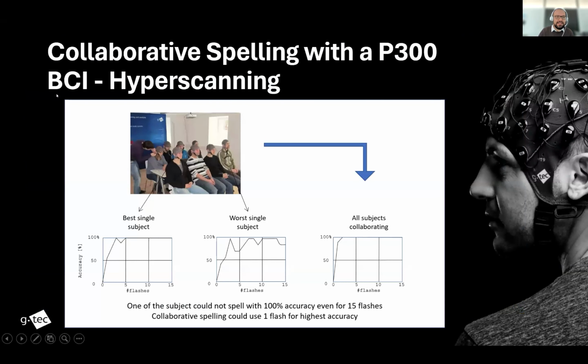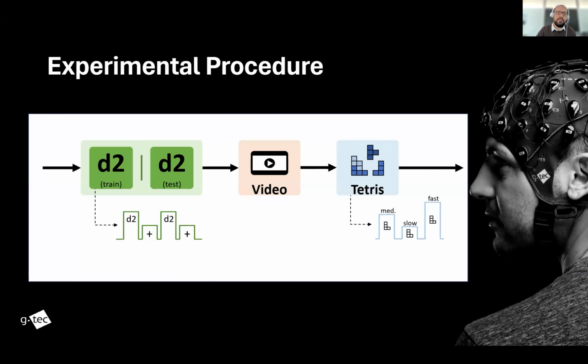and we were trying to catch the engagement of all of them and rate it with a bar that would move up depending on how engaged they were during this process. The experimental procedure at that time was doing the D2, which is an engaging task, very similar to what we will do today, where people have to select all the Ds with 2 points, which will engage them and make them concentrate.